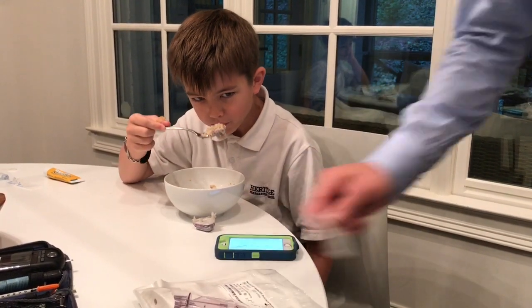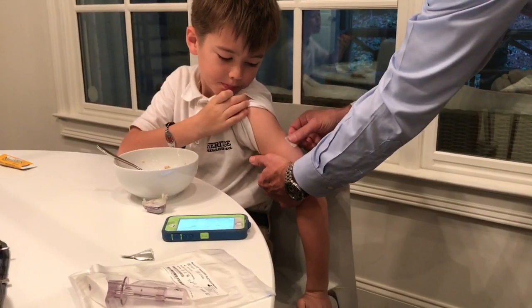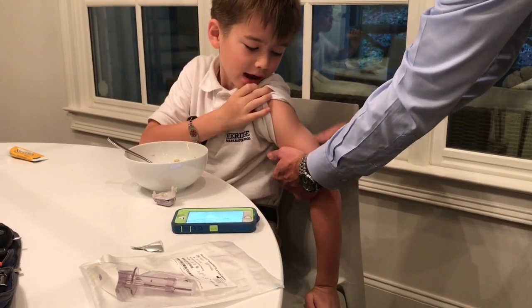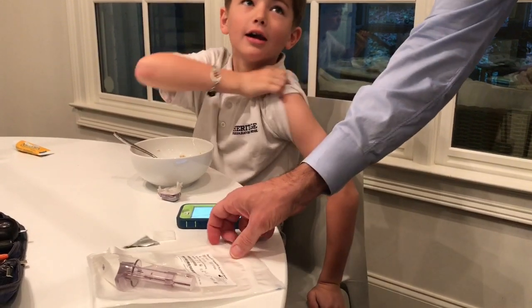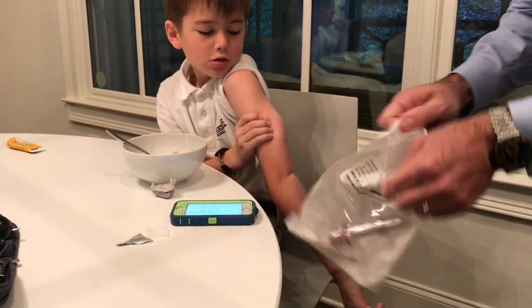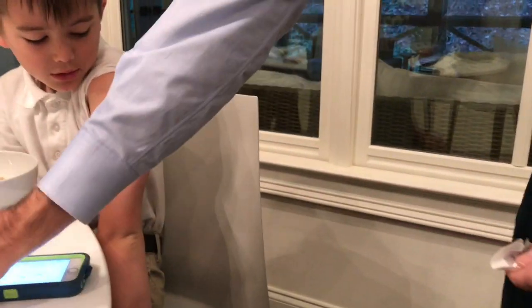We're going to put this one right here on the arm. First, I'll clean the spot that the Dexcom will go. Now while it's drying we'll get the new one out.